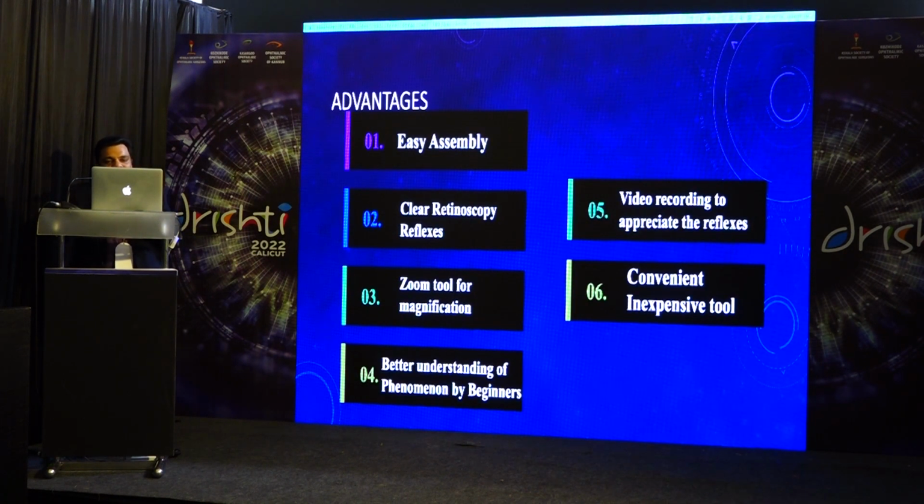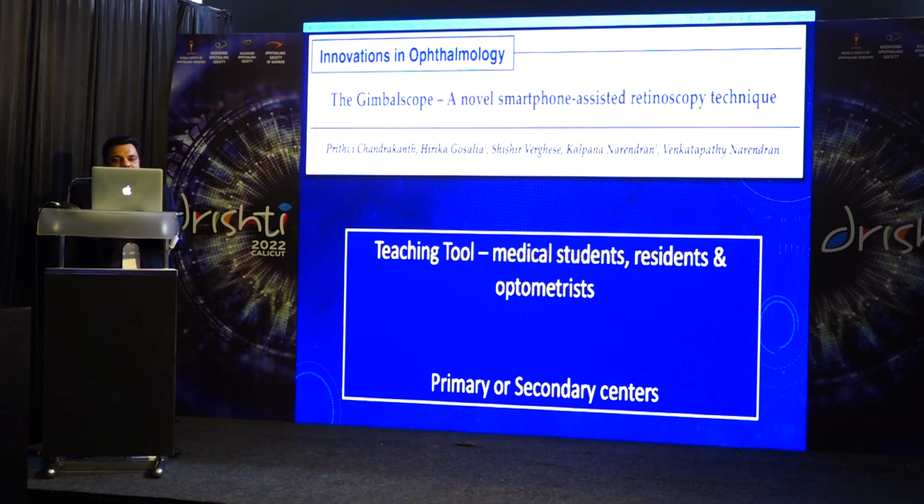So the advantages are easy assembly, clear retinoscopic reflexes, and a zoom tool for magnification. It gives better understanding of the phenomenon for beginners. Video recording is important, you can appreciate the reflexes and see them later, and it's a convenient, inexpensive tool. So it's a teaching tool for medical students, residents, and optometrists, and can be used in primary or secondary centers.